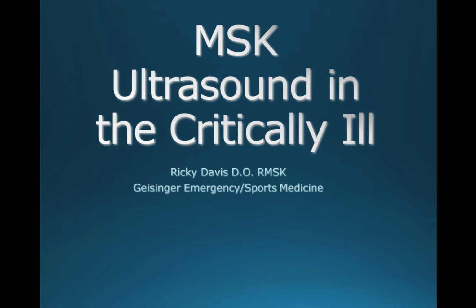Okay, this is Dr. Richard Davis coming to you from Geisinger Emergency Medicine Sports Medicine Program in Central Pennsylvania. This lecture will be on musculoskeletal ultrasound in the critically ill.